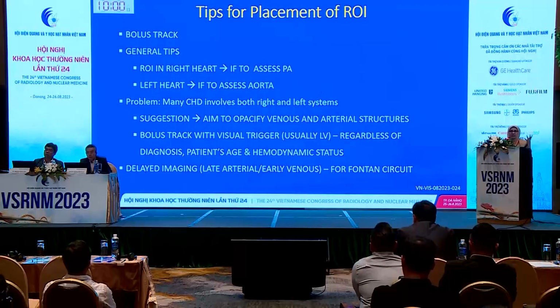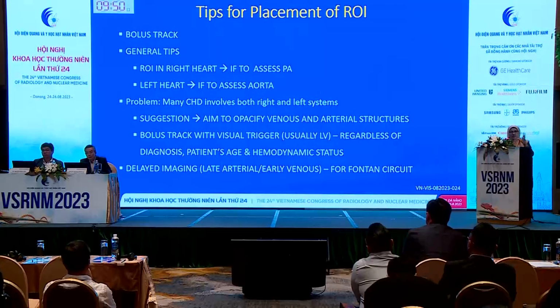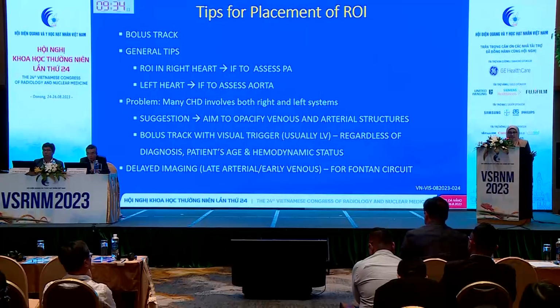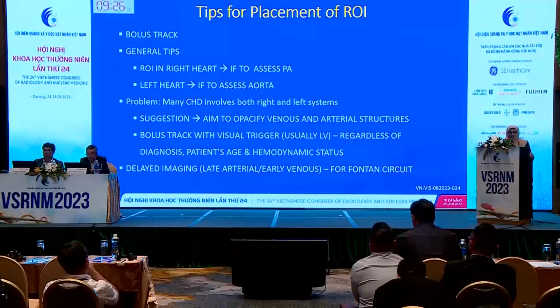But the problem is when you deal with congenital heart, you have both right and left systems involved. So what I can suggest is that we try our best to opacify both venous and also arterial structures. And by saying this, we prefer to have bolus tracking with visual trigger usually located at the left ventricle. This is from my experience regardless of the diagnosis of the case, patient age and also the hemodynamic status. And of course if beforehand you know that the patient has some extracardiac conduit, for example in Fontan, you may need to delay your scanning.